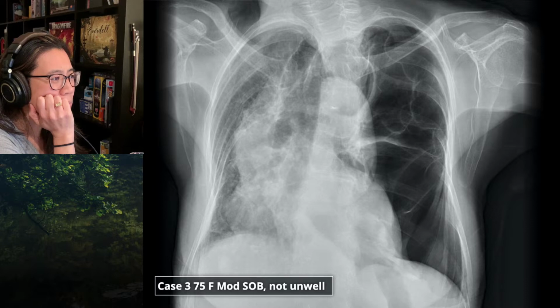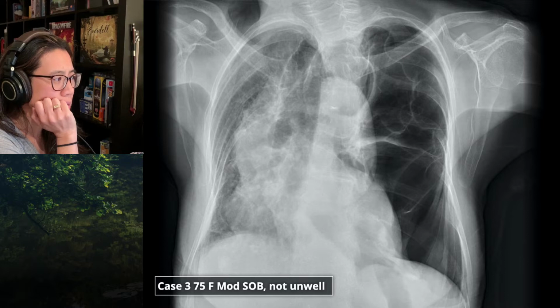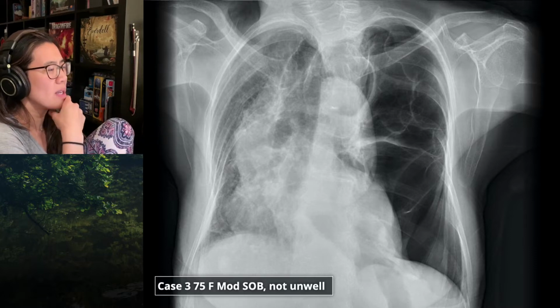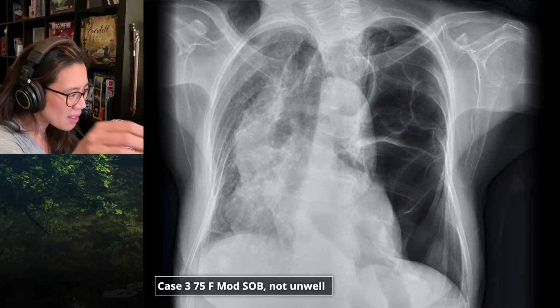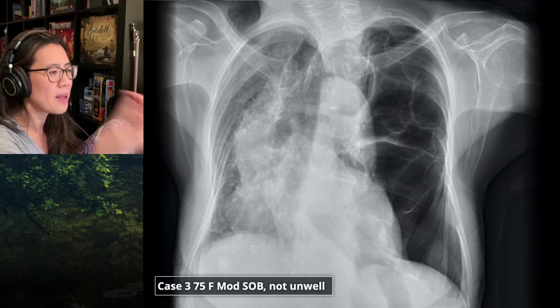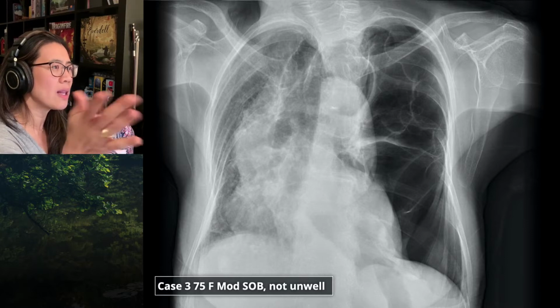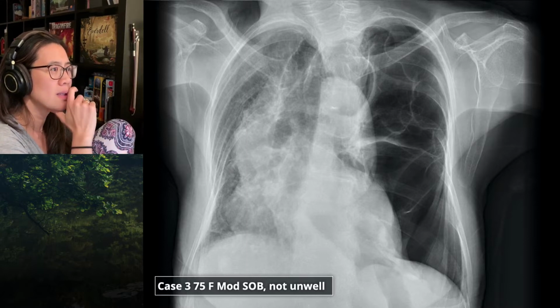And why did you say tension? Because the mediastinum shifted to the right. Yeah, got to be careful because she's quite rotated. So are you certain if it is a pneumothorax, is it under tension or isn't it? I don't think that I could exclude it on the basis of this X-ray. Is the diaphragm depressed? Yes, no, or uncertain? I think it's a little bit depressed, and it's lower than the right. But I think the fact that she's not unwell makes me think that it's probably clinically not under tension. But I don't think that I could exclude it on the basis of this X-ray.